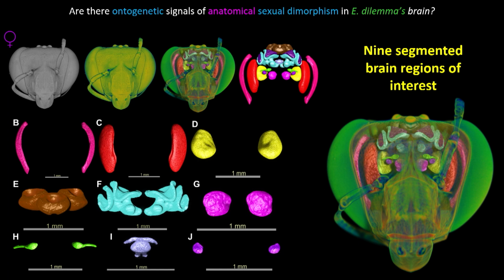And she does want to study multiple examples of these, potentially up to 100 of these. And so I think deep learning will be a very important aspect of this. The problem that I'm having right now is finding the right tuning parameters and downsampling to get the data we need in an appropriate training time. So that's some of the things that we're toying with right now.